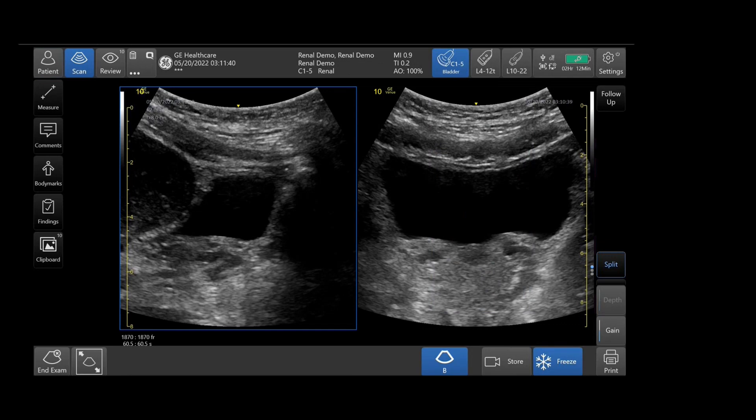Next, you will obtain longitudinal and transverse images of the bladder using the split screen option. Split screen allows for easy viewing of all planes of the bladder and can be activated from the right side menu.